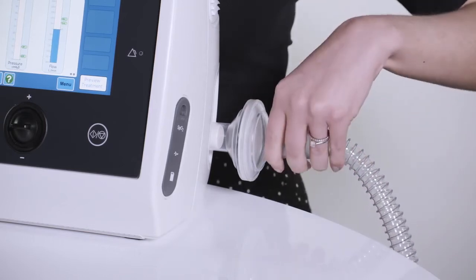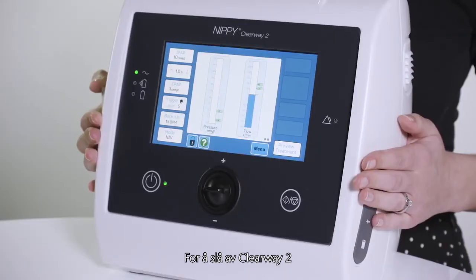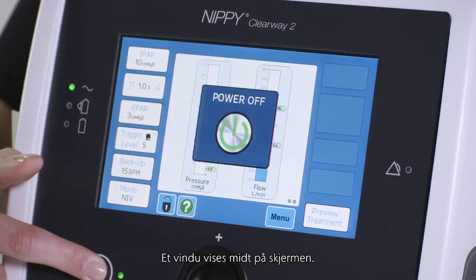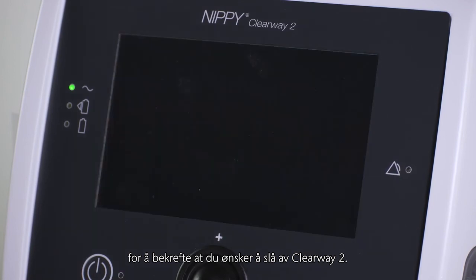Once the treatment has finished, disconnect the breathing circuit and store safely. To switch off the Clearway 2, press the power button on the front panel. A window will appear in the middle of the screen — press the power button in the window to confirm that you wish to switch off the Clearway 2.